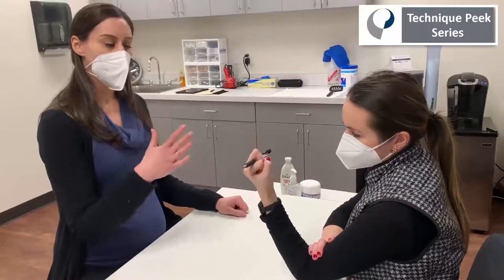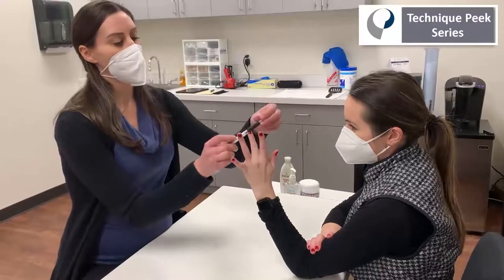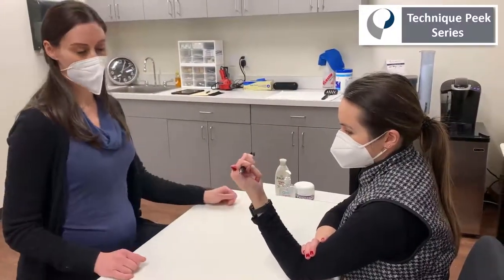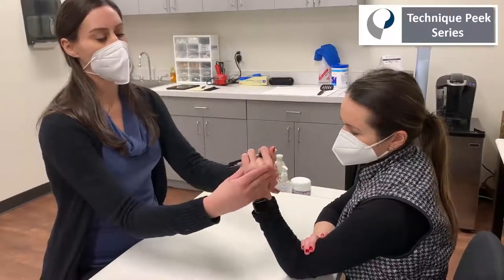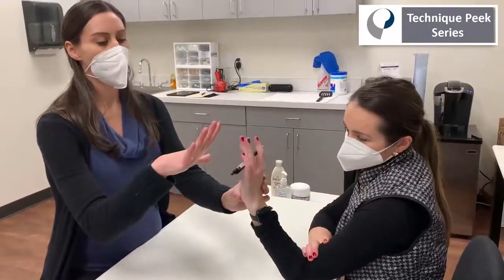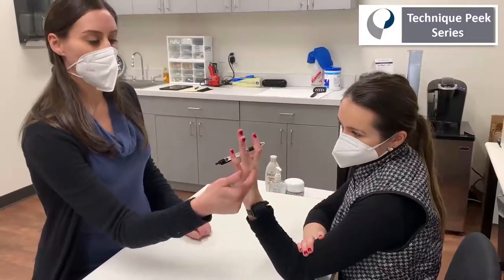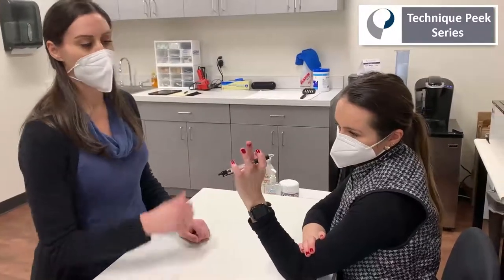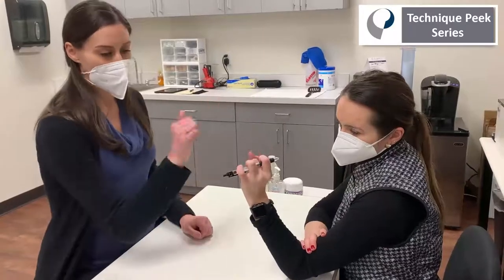If you want to work on extension, you're going to put that middle finger with that MP joint in more flexion in comparison to the adjacent digits. So then as they open up, the extensor digitorum communis isn't really working on that MP joint as much — it's been redirected to that PIP joint and it's working with the interosseous muscles to work on PIP extension.